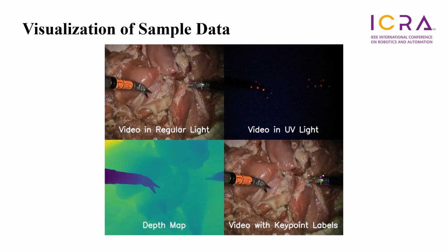This page is a visualization of a sample data. Since we have calibrated stereo camera parameters, we can use a stereo matching algorithm to calculate the depth map.